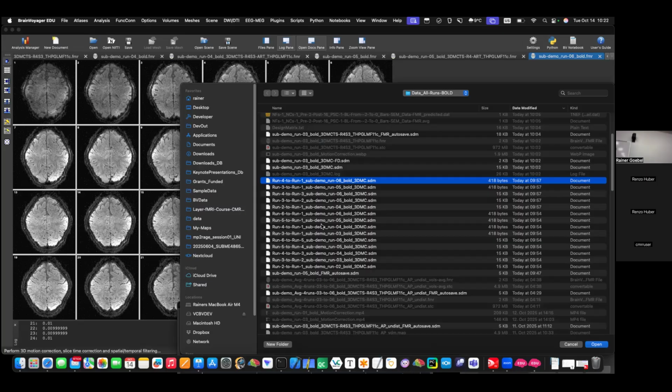I want to first do the motion correction. You could also take 5 volumes, do motion correction of the 5. Yes, you could. But I tried playing with this, and it doesn't change much, because at the beginning, the first volumes depend on how much motion. Yeah, that's true.